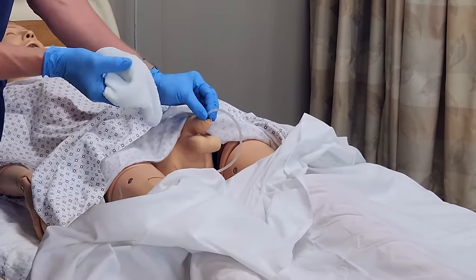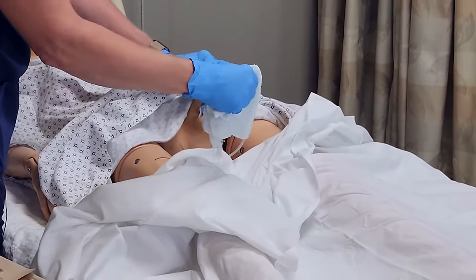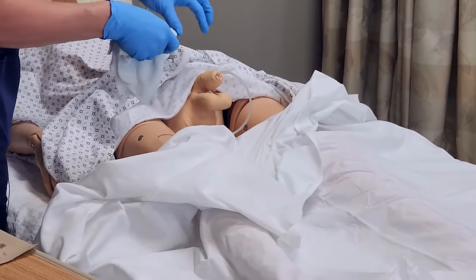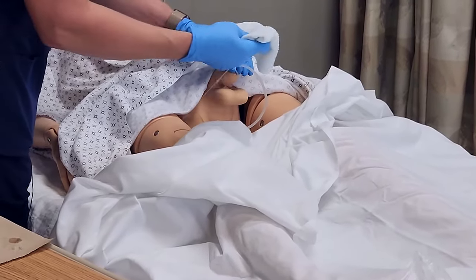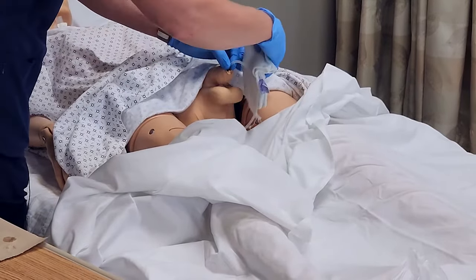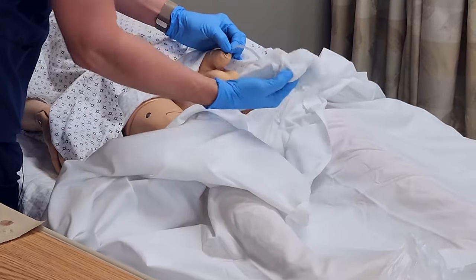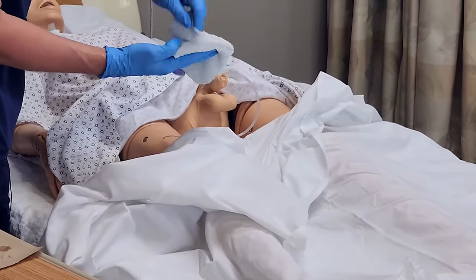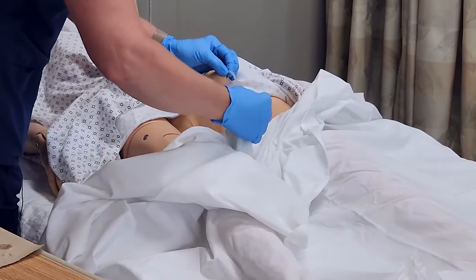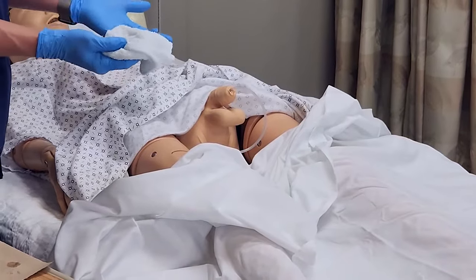I want to hold the catheter as close to what we call the meatus — which is the urinary opening — so that we don't tug on the catheter, because that's uncomfortable. There's a balloon at the bottom of the bladder that keeps the catheter in, and that will cause a lot of discomfort for the resident. So I'll hold as close to the resident as I can, use my soapy washcloth, and clean down at least four inches, then flip the cloth over and clean again. If catheter care has been done routinely, two passes is probably enough.